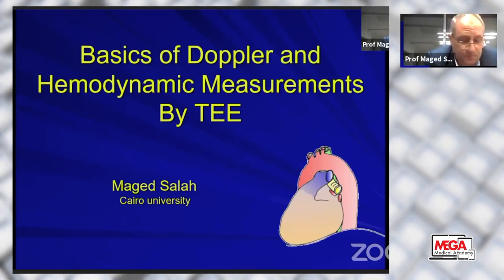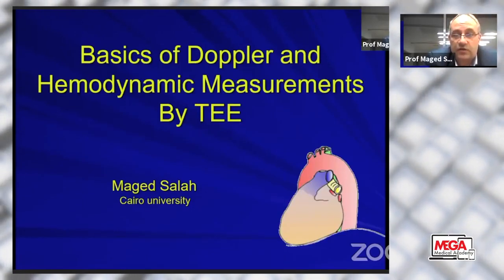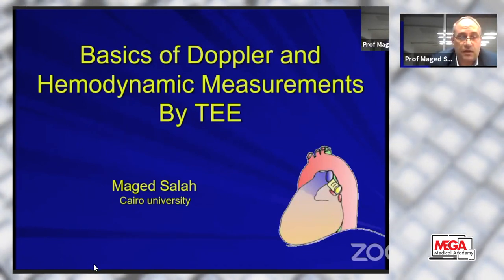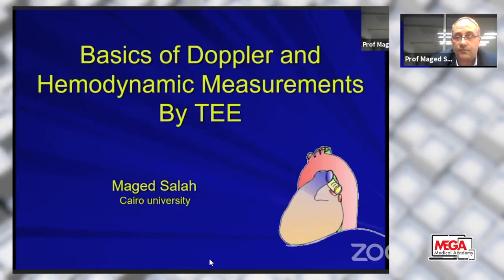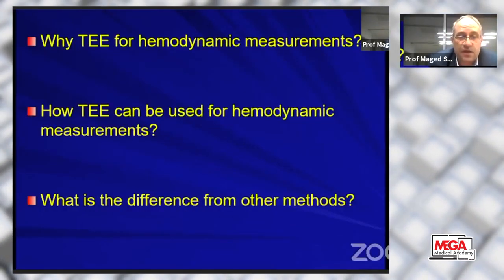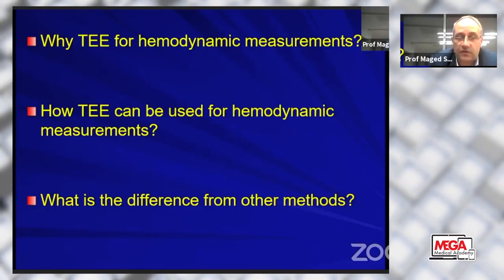I'm happy to be again with the Mega Online course. My presentation today is about the basics of Doppler and hemodynamic measurements using transoesophageal echocardiography. I'm going to discuss why we are using transoesophageal echocardiography as a hemodynamic monitor, and how it can be used for hemodynamic measurements. The basics, of course, and I will leave you to define the difference between transoesophageal echocardiography and other methods.